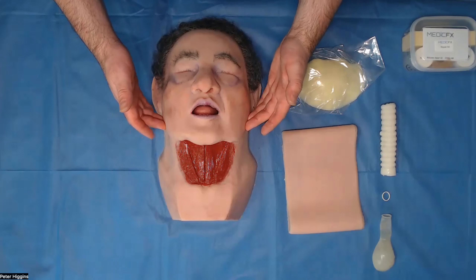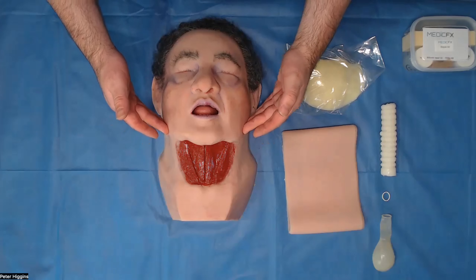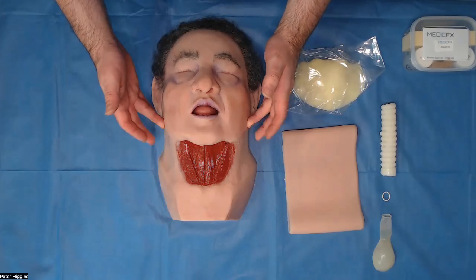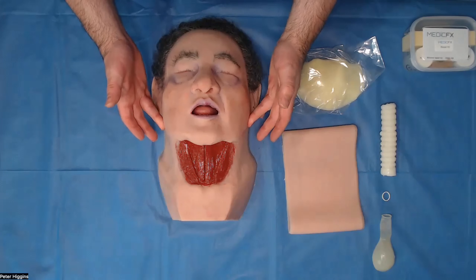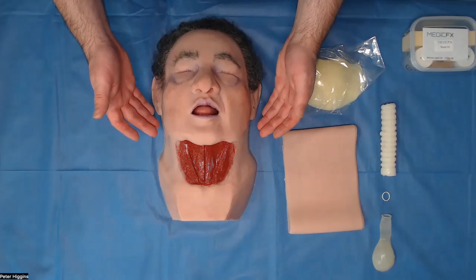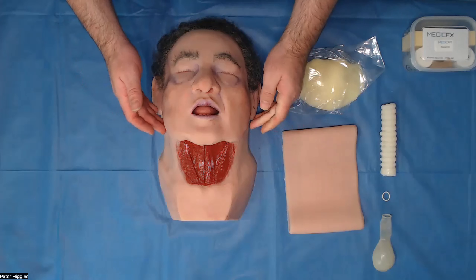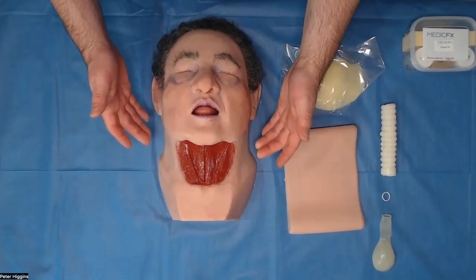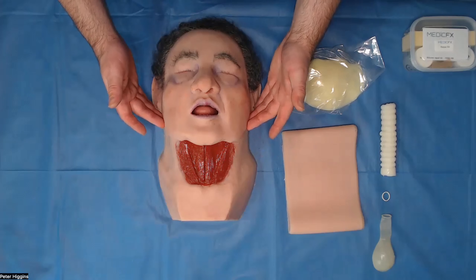So when you put that laryngoscope in, it is a horrific view behind there. It's very, very difficult to actually get a tube or a bougie even in the correct place. You could probably have a go with video laryngoscopy and get a better view, but whether you would be able to get your bougie and tube into the right place is another thing entirely. But that's not what this model is built for, even though it is something that you can attempt.